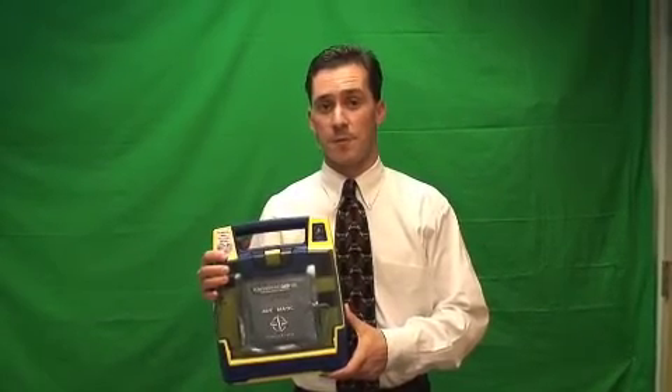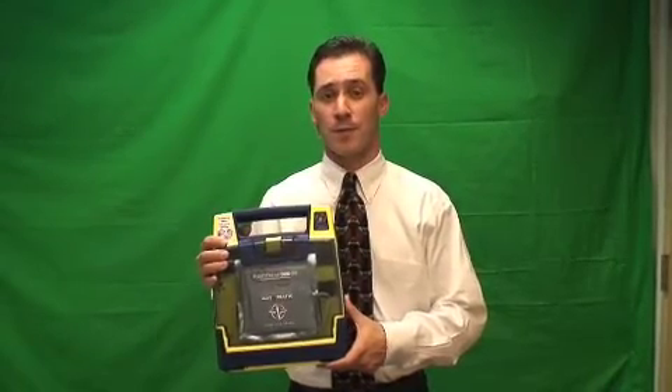The G3 Plus AED has a seven-year warranty on the unit and a four-year warranty on the battery. DOCS also offers a lifetime loaner guarantee. Should anything ever go wrong with your unit and need service, give us a call and we'll ship you a loaner unit so you're never without an AED in your office.